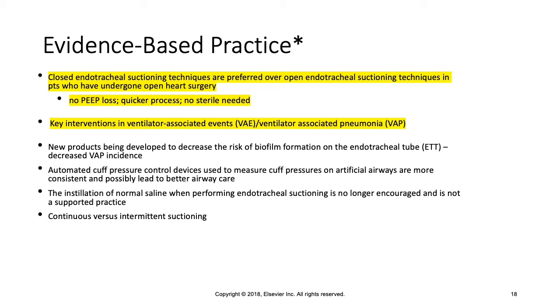So you'll see this in lab, but you will insert the suction catheter into the tracheostomy tube. While you're inserting that suction catheter, you do not apply suction. It's applied when the catheter is removed. So the suction catheter is inserted down into the tracheostomy tube until you meet resistance or the patient begins to cough. That's an indication that the suction catheter has reached the area of the carina. So then you pull back about 1/2 inch and you start suctioning.